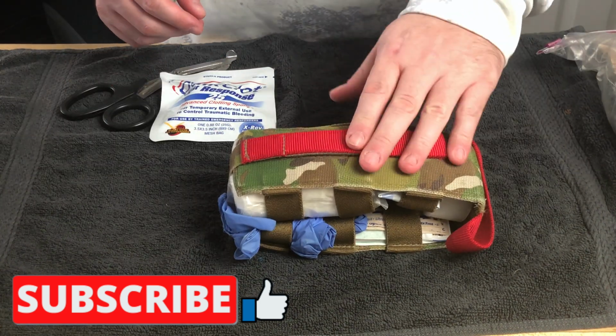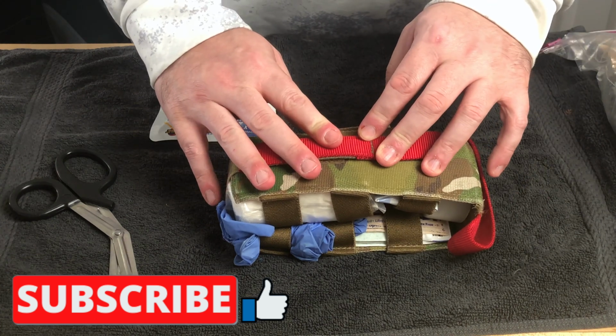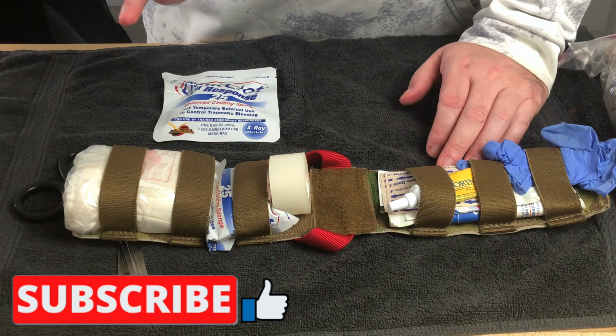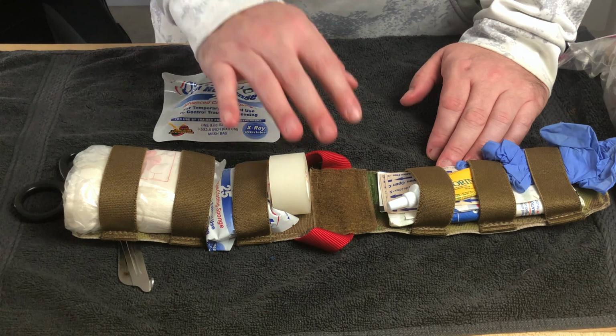This one assumes you have the scissors packed separately. This one is specifically designed to go into double magazine pouch. It's ATS, I believe, yeah. We've got a mix of snivel kind of gear and trauma, but bare bones.